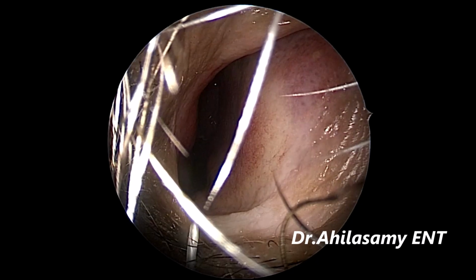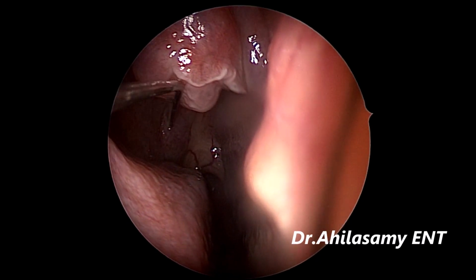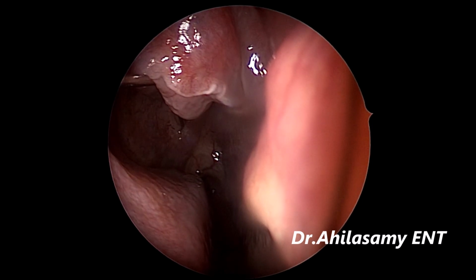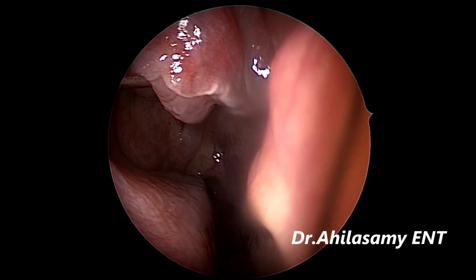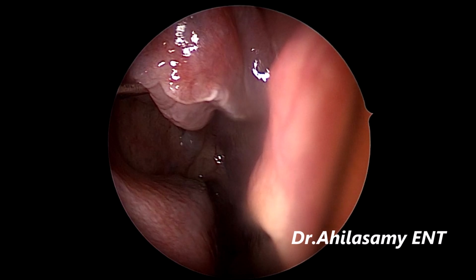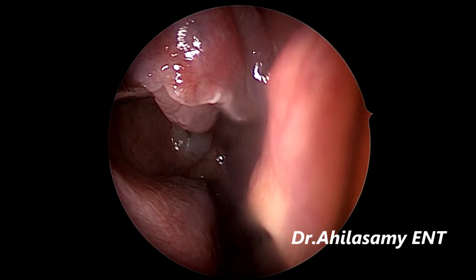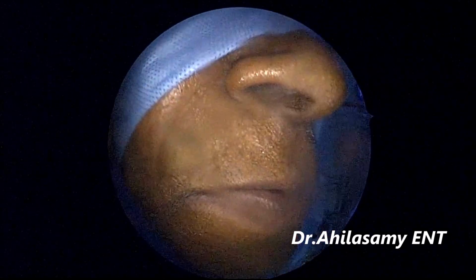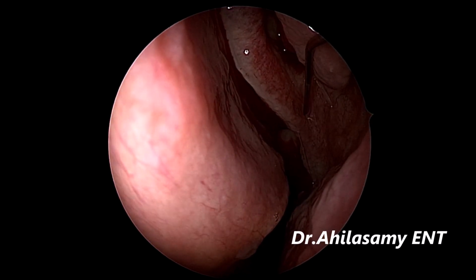Patient is very comfortable under local anesthesia. He is a 76-year-old male patient. This is a 23 gauge spinal needle bent, and I am giving the sphenopalatine block where the middle turbinate curves and joins the lateral wall. You can see the blanching. I am repeating on the other side also.